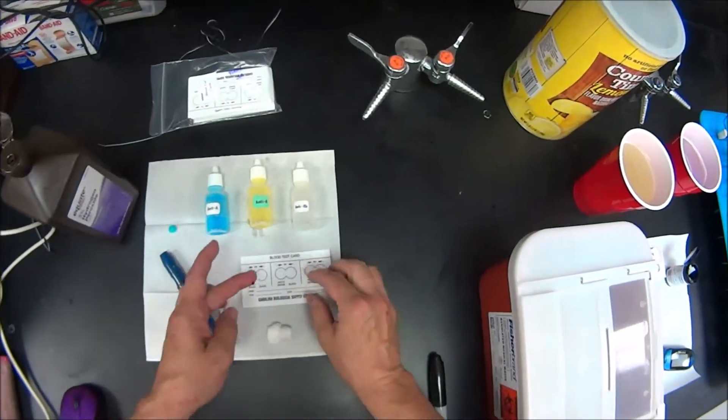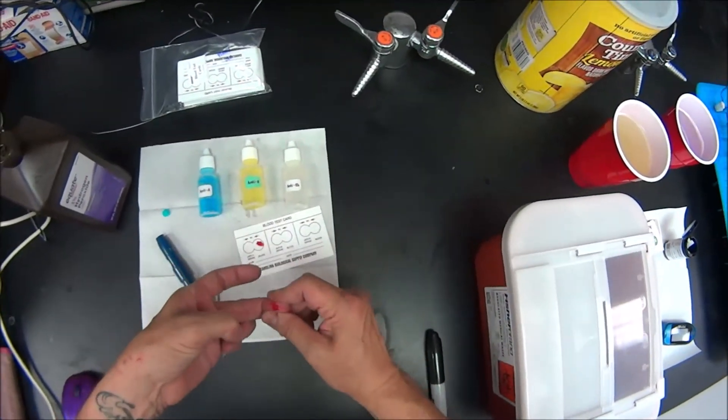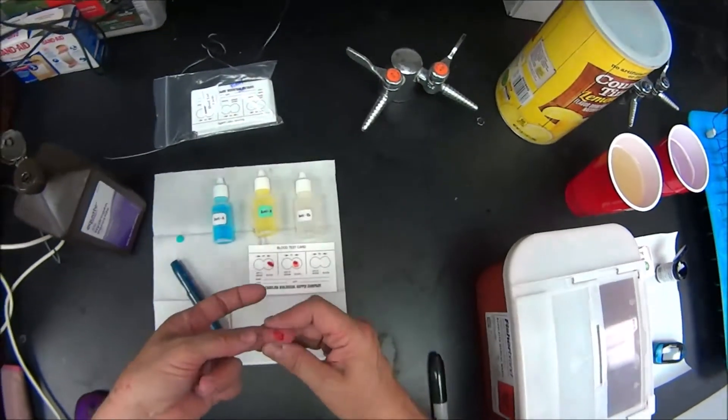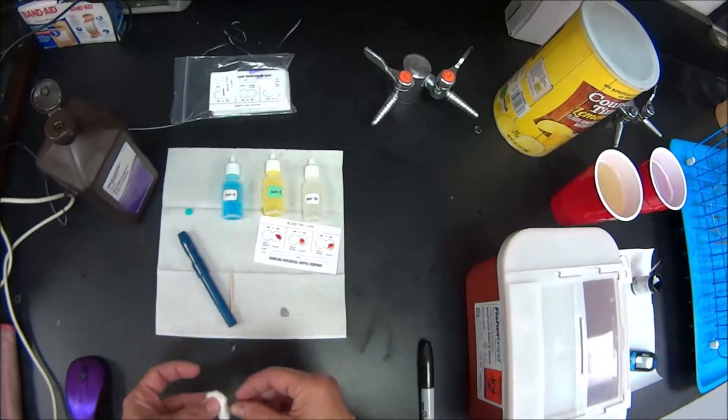Okay, I got a little bit of blood. I'm going to put it where it says to put blood on the card. So I'll squeeze it again. Don't pass out on me now. Squeeze it again. Boom! Okay, let's clean that finger off.